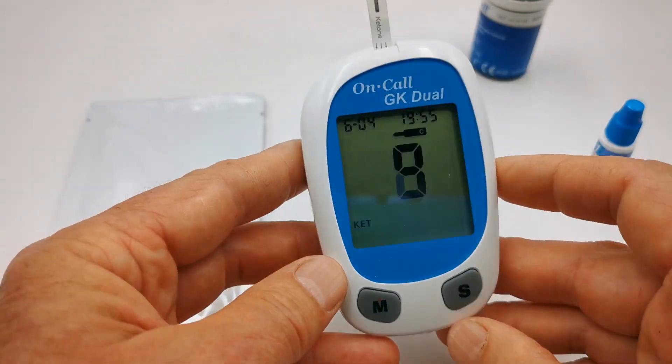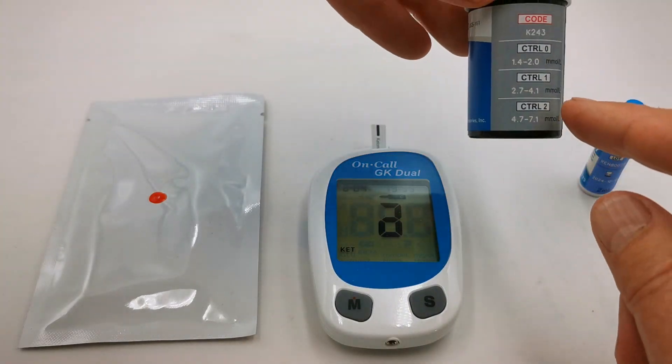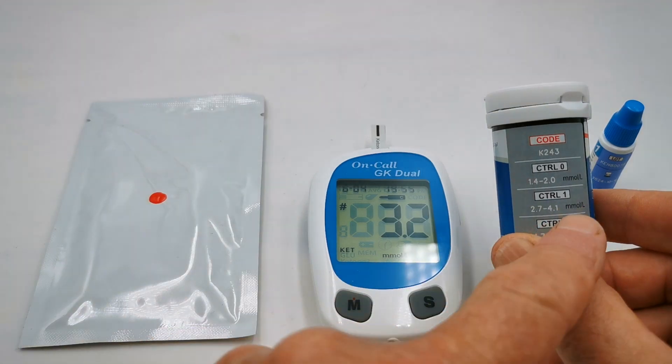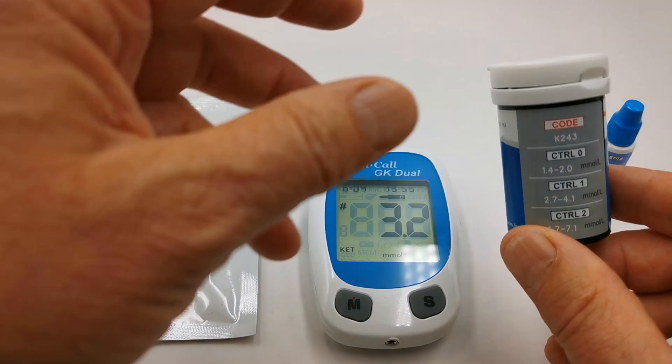You should hear it beep and it starts counting down. The reading that you're looking for — the range — is displayed on the side of the test strip vial for controls zero, one, and two. We're looking at control one for a reading of between 2.7 and 4.1. We're getting 3.2, which is fine.